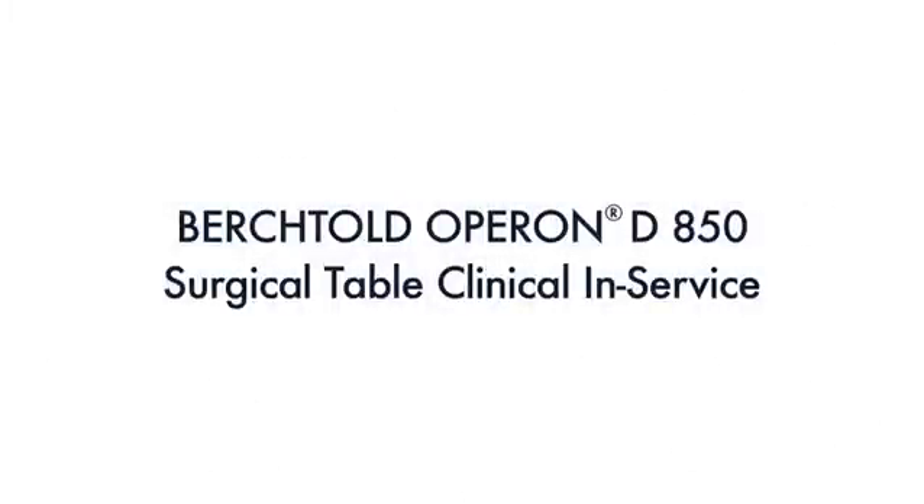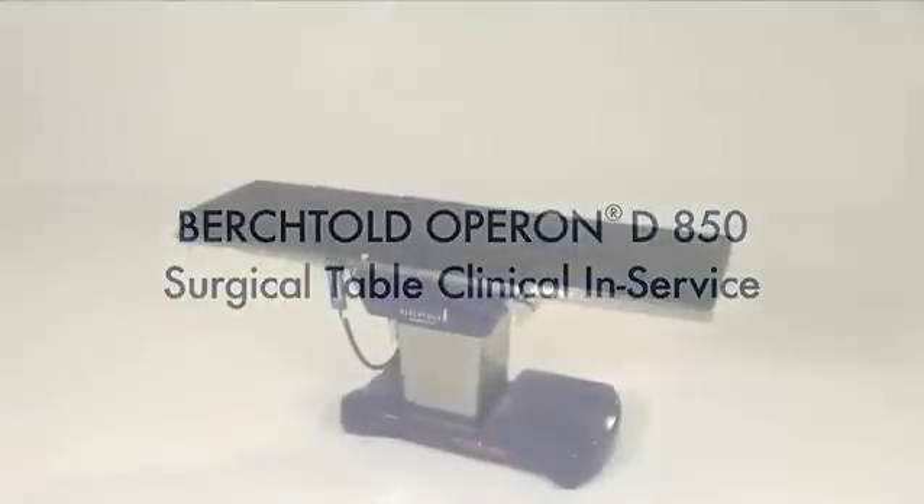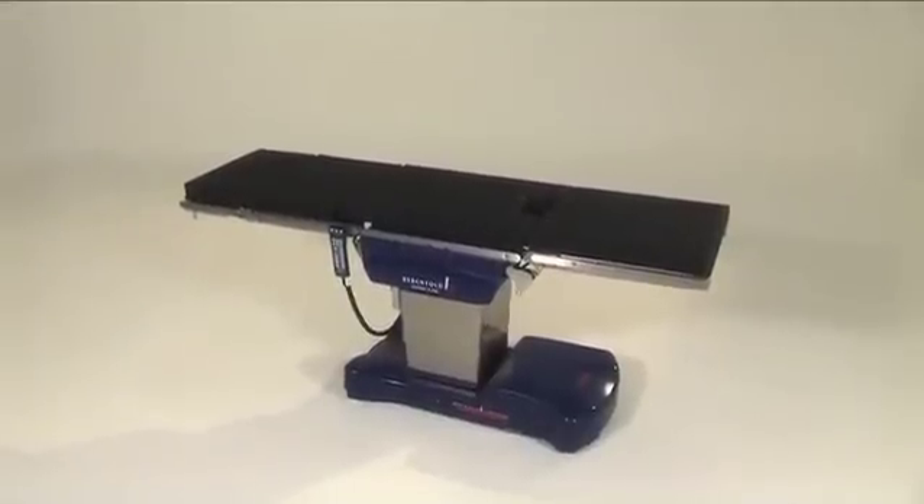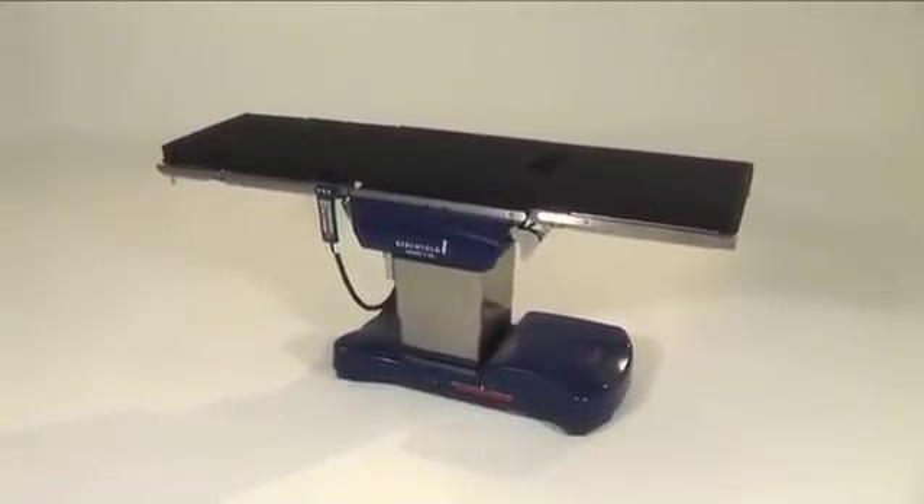Welcome to this video presentation of the Berktold Operon D850 Surgical Table Clinical In-Service. The D850 is Berktold's most advanced and feature-rich surgical table, setting the industry standard for innovation in the operating room.